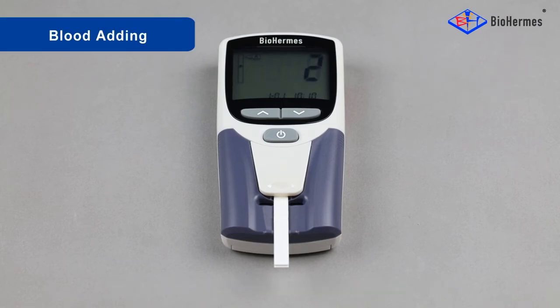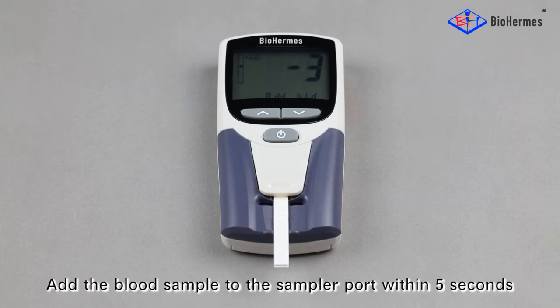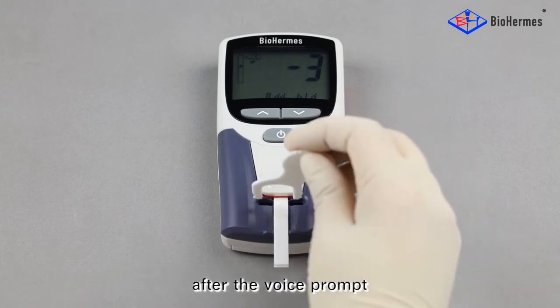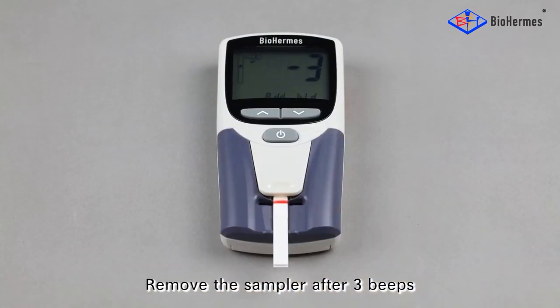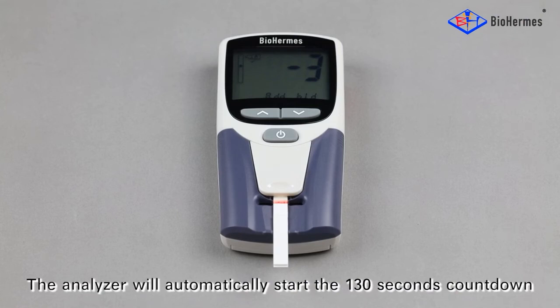Blood adding: add the blood sample to the sampler port within 5 seconds after the voice prompt. Remove the sampler after 3 beeps. The analyzer will automatically start the 130-second countdown.